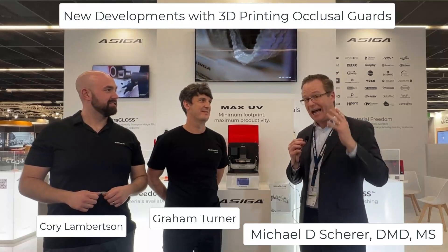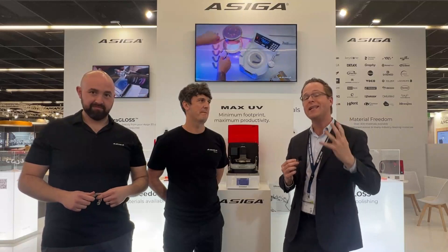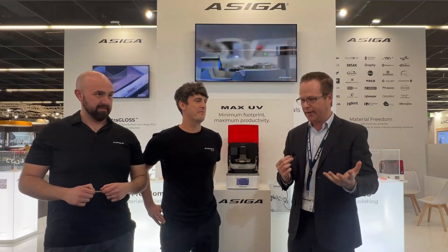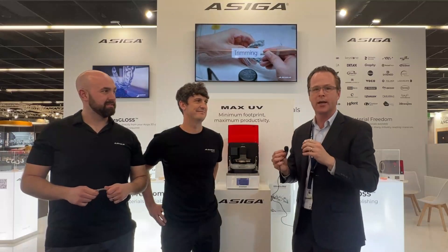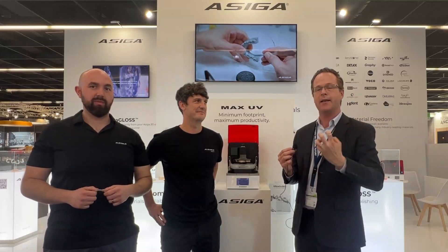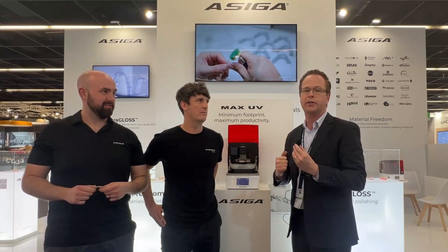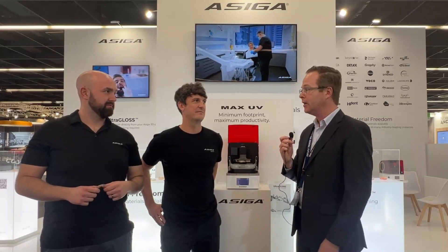Hey everybody, this is Dr. Michael Scherer coming to you from IDS Cologne here in Germany. I'm here at the Asiga booth wanting to know about the latest in 3D printing and how we can reduce manual polishing of occlusal guards. There's something that drives me crazy when dentists get together discussing how to make printed appliances super shiny. I was inspired when I came to the booth and heard about something called UltraGLOSS. I've got Graham and Cory from Asiga to talk about the latest updates in 3D printing, especially occlusal guards.